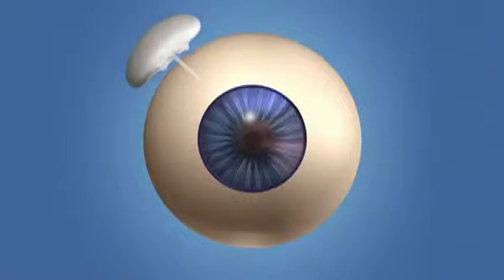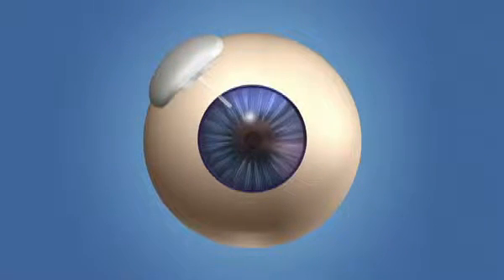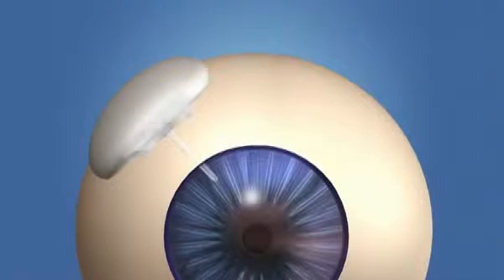The drainage tube creates a new channel for fluid to flow from the eye to a filtering area called a bleb. A tiny plate placed on the eye helps the bleb form and remain open. The tube is covered with a patch and is typically not seen or felt.